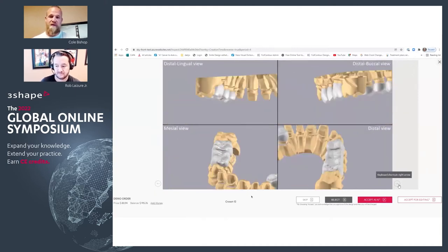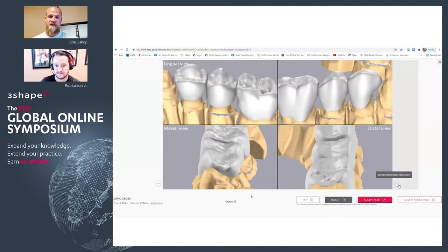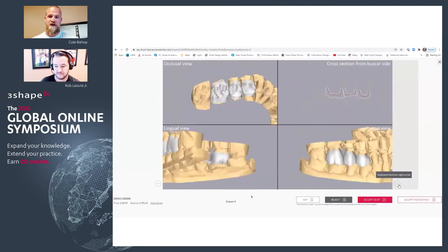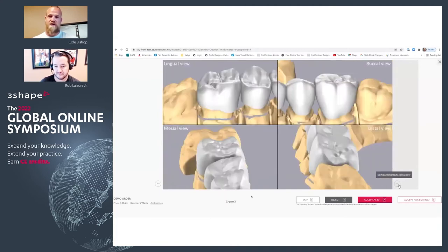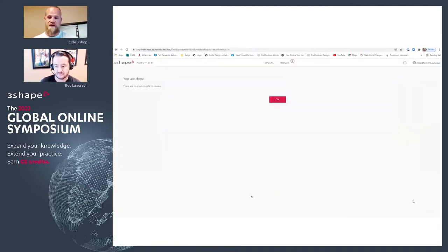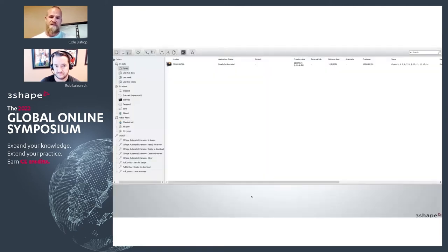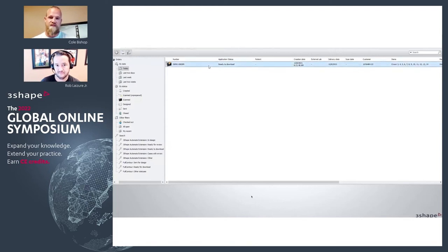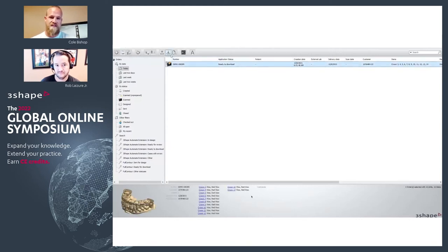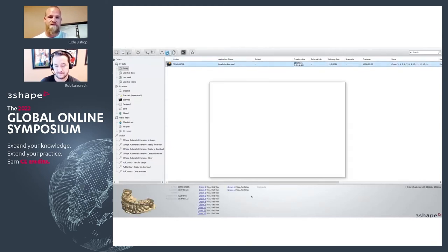If you're happy with how everything looks and it looks as though you can make some minor adjustments to these posteriors, simply hit Accept for Editing. Then you'll go back to your dental system and you can download this and see the application status change to Ready for Download.